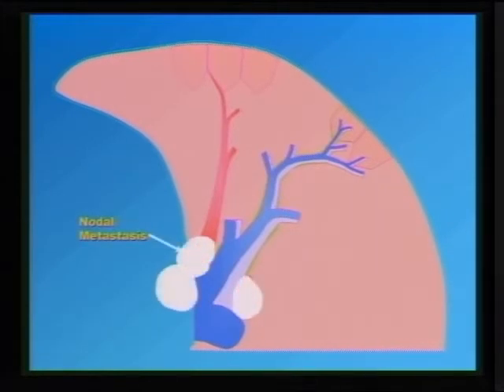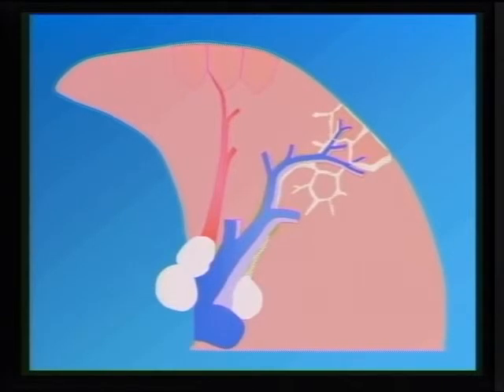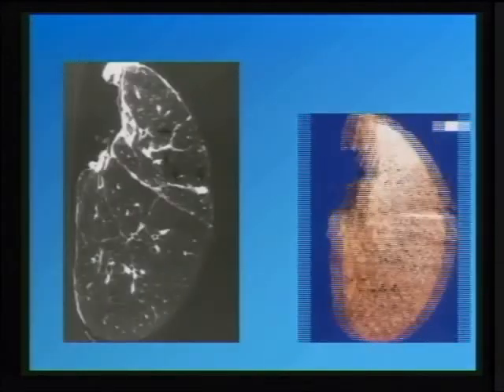The other thing is, if you don't have hematogenous spread, then look for retrograde invasion of the lymphatics by tumor, by having central hilar disease, lymph nodes filled with tumor, and then you have a retrograde filling of the lymphatics by direct invasion from the lymph nodes into the interstitium. So you need to look for those two things, and most of the time you'll be able to find one of those two entities in order to make that diagnosis.